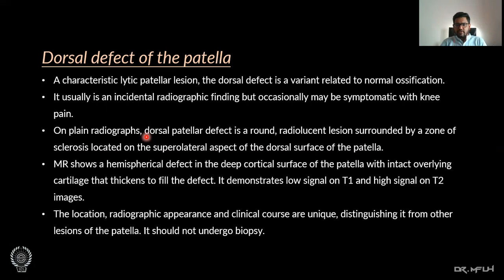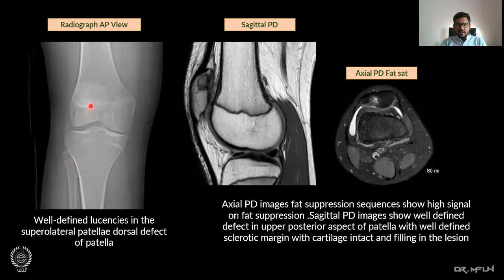The location, radiographic appearance, and clinical course are unique, distinguishing it from other lesions of the patella. It should not undergo biopsy as it is a benign condition. Here we can see an AP radiograph of the knee showing well-defined lucency in the superior lateral aspect of the patella suggesting a dorsal defect. Sagittal proton density and sagittal proton density fat-sat images show high signal intensity in the upper posterior aspect of the patella with a well-defined sclerotic margin and intact cartilage filling the lesion.